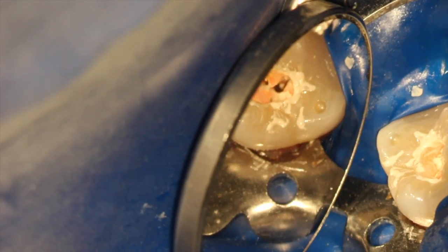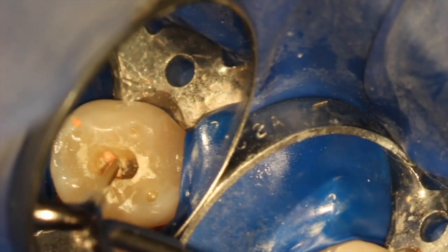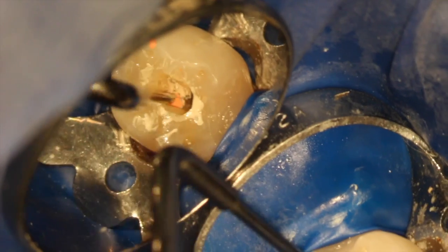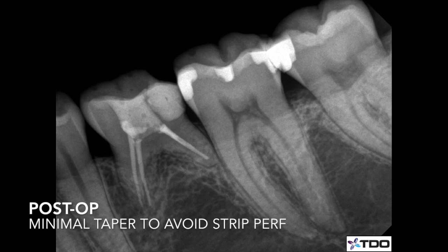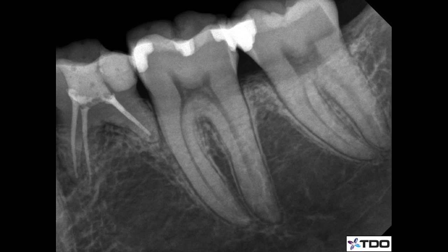Obturation varies depending on where you're trained and your experience, but this tooth was obturated warm vertical, backfilled. I essentially have just one or two pluggers — it's not rocket science, it's really just carefully filling the canals. You can see post-ops showing great results — lightly flared, and there's a buildup; Luxicore was used as a buildup. There were three canals in this case. Thank you, and leave me your comments.